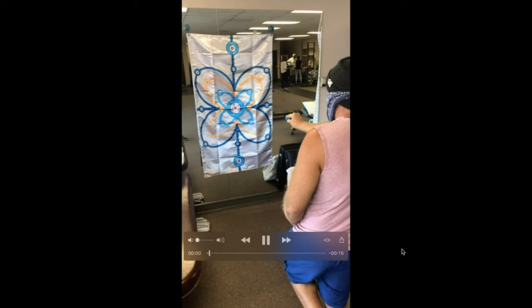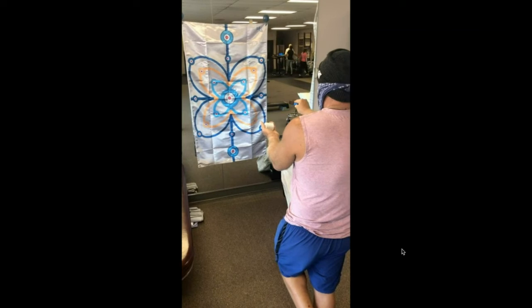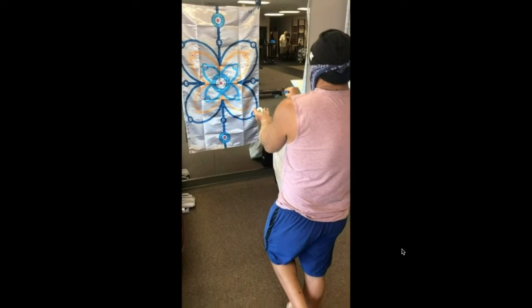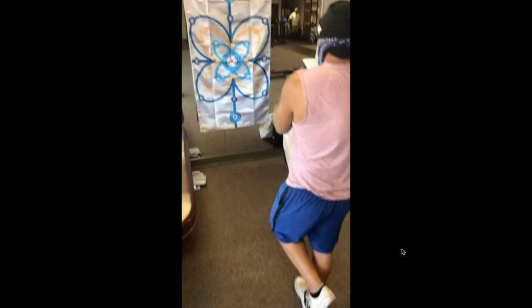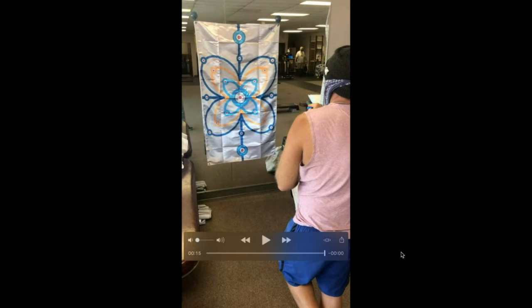So if we play the video out here, you can see the complex movement pattern with the right hand. Want that elbow extended if possible. And then he's going to have to do a prediction task with dual tasking with the toss and catch. And he's on one leg. There's me videotaping. Okay, so we can watch that one more time.